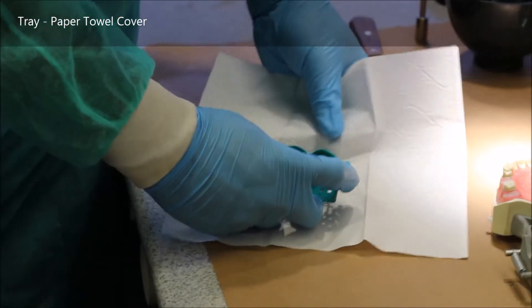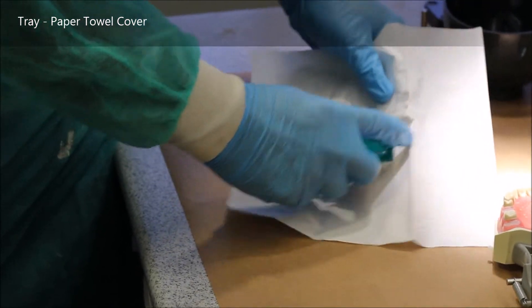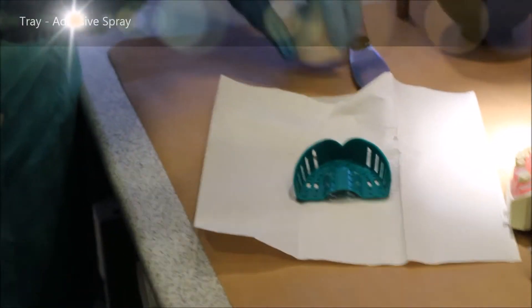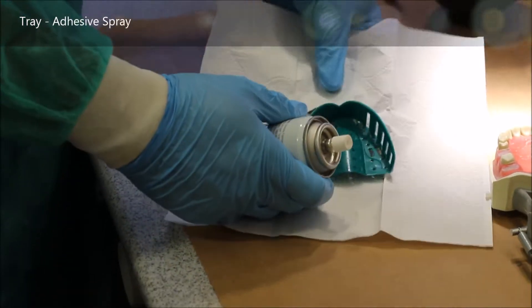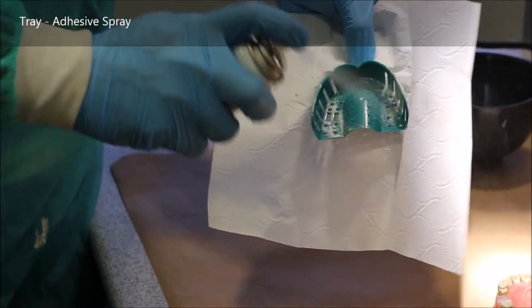You take your tray and poke the handle through the paper towel in order to give yourself an area where you can spray adhesive without ruining your workbench. You spray a light coat of adhesive all over the tray.